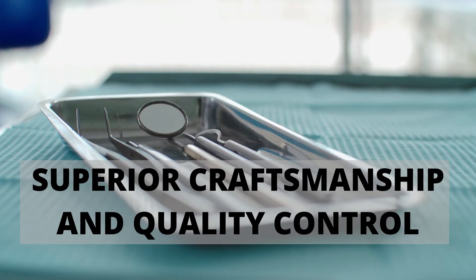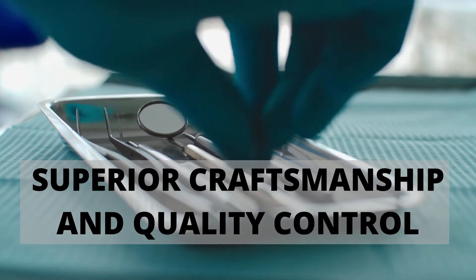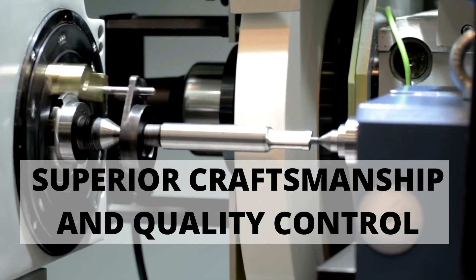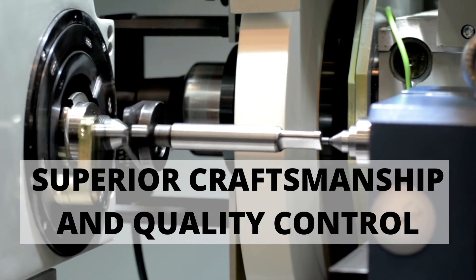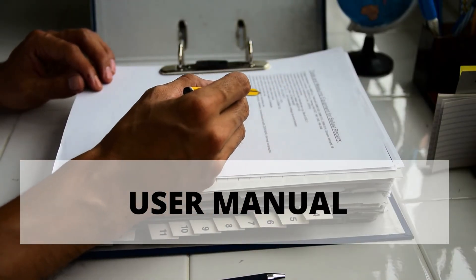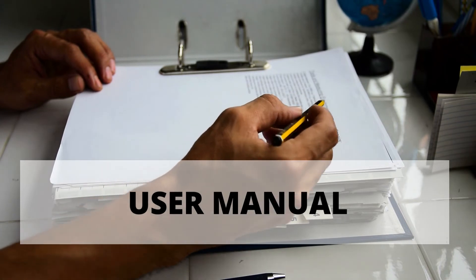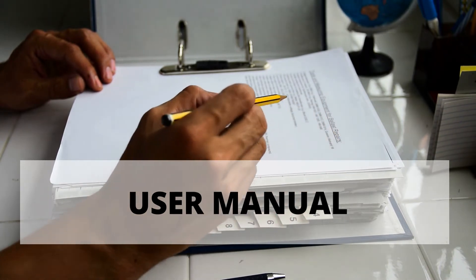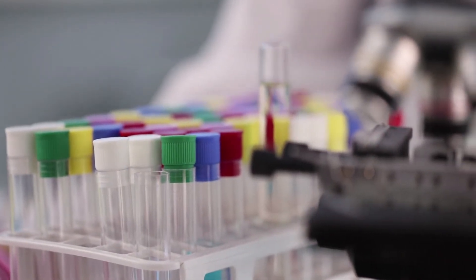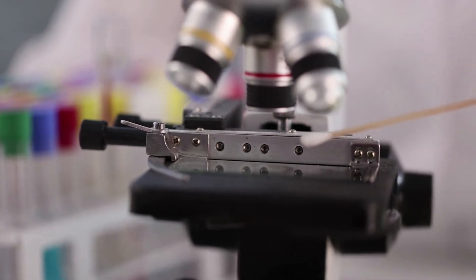This high quality instrument is made from surgical grade stainless steel and is handcrafted by highly trained instrument makers. The instrument is surface treated to give it a matte finish. It comes with an instruction manual covering cleaning, care, and storage. All instruments conform to surgical instrument guidelines by the EU and FDA, and are reusable and autoclave safe.